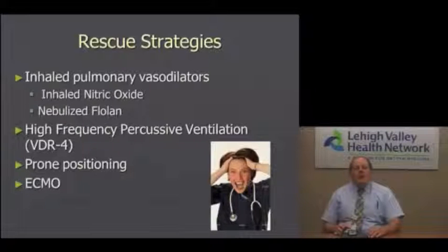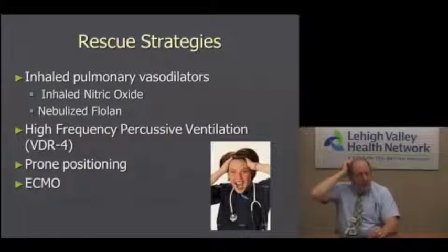So what I'd like to do is get into what's now known as the modes of ventilation. And for years, there has been a struggle over which is the better mode of ventilation. And interestingly, after doing this for over 40 years, a meta-analysis paper came out which looked at which is the better way of delivering the breath, volume ventilation or pressure ventilation. This paper is 52 pages, and of course I'm goofy enough to sit there and read it at my bedside before I go to bed.